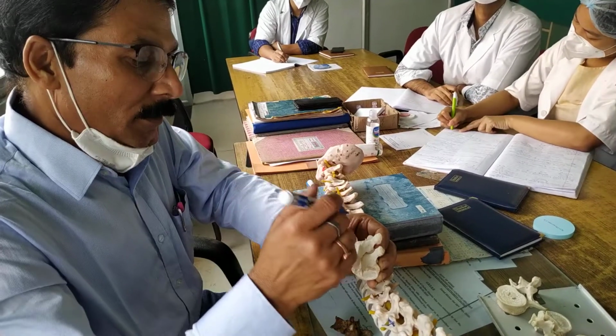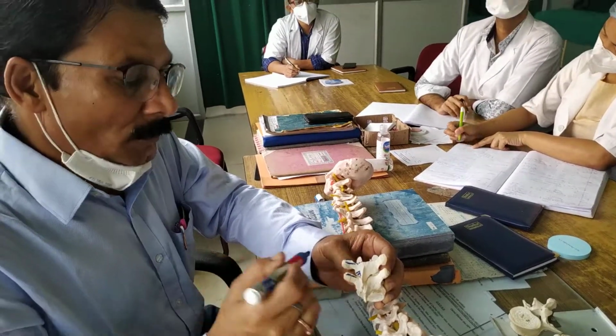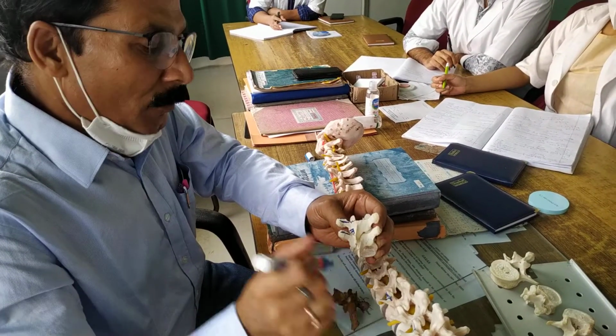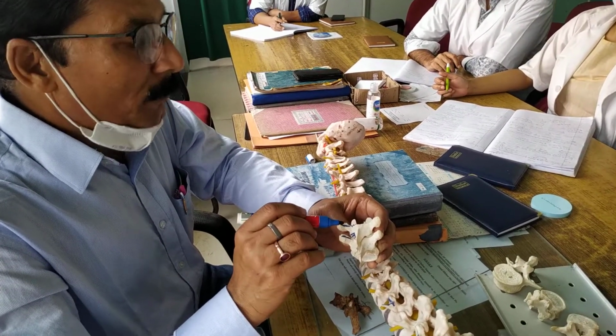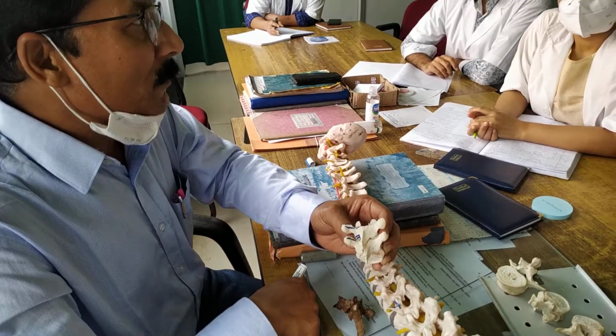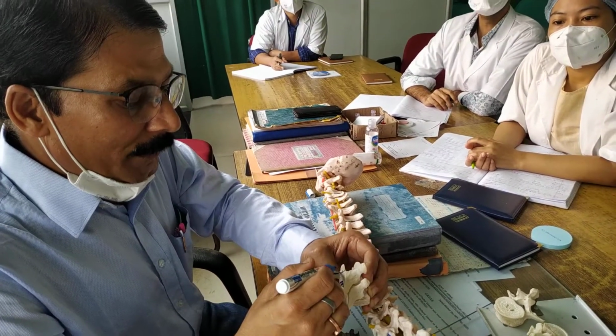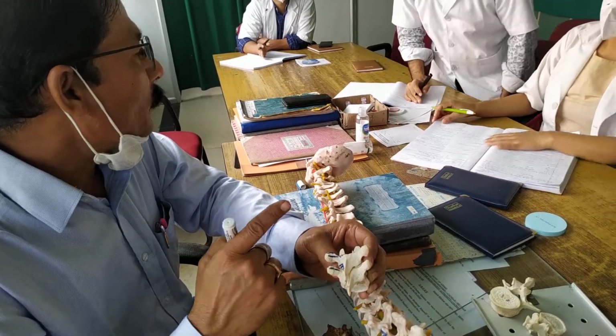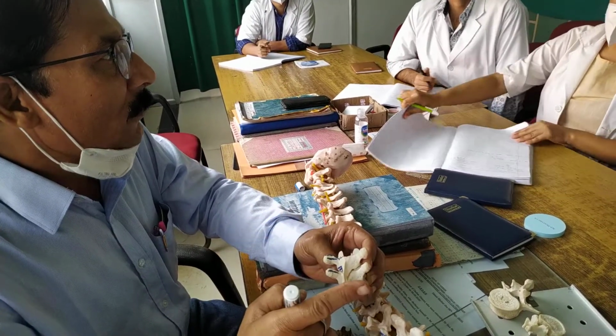Clear? This part is already exposed. We have already exposed the transverse process here, its superior border and inferior border. We have divided the transverse process into 3 equal parts, upper 1/3, middle 1/3, lower 1/3.